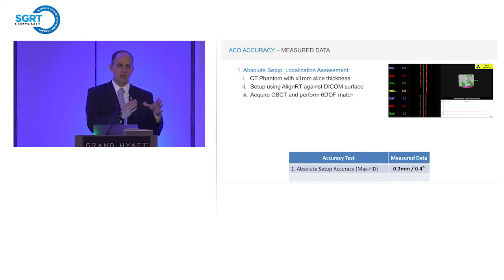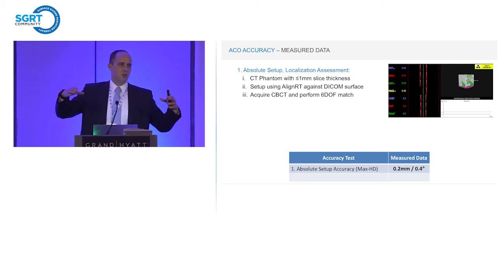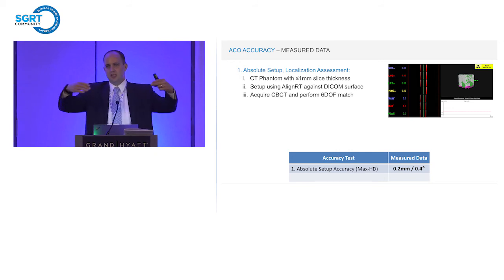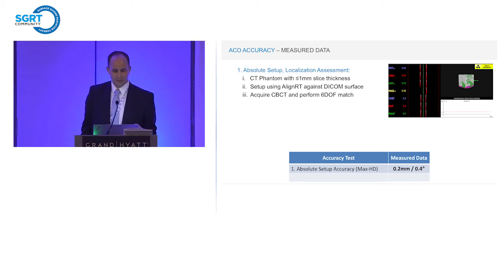We get better resolution if we're rotated, so we're not parallel to the slices. Also, in the treatment room, when we're using surface guidance to view the cube, if the cube's rotated to 45 degrees, our lateral cameras can actually see 2 of those vertical faces each, versus if it's at the 0 position. So I think just a little tip there.